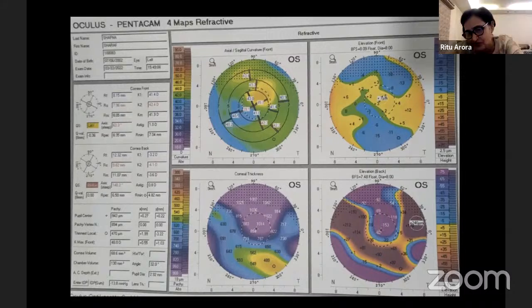So that's where the point of Dr. Srivalli comes, that I would like to see the patient. Yes, ma'am. Okay, so you could have said it's a thicker cornea, it could be edema, could be hypertrophic scar. That's fine. If Anil had not shown us those OCTs, we wouldn't have come to know about it.